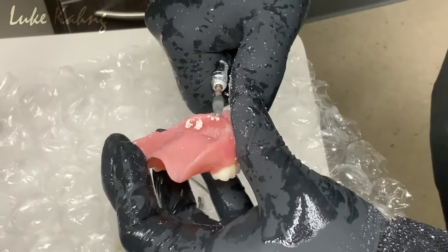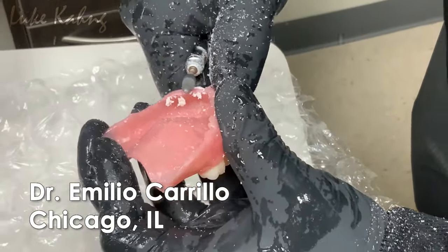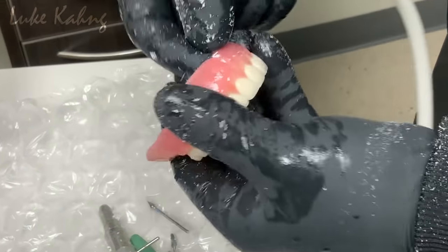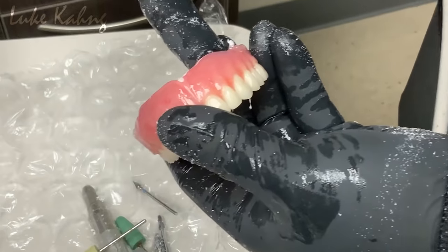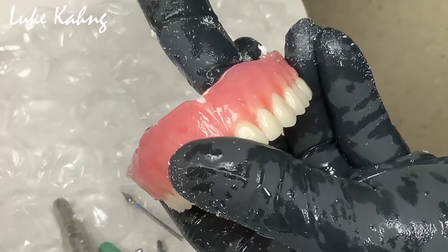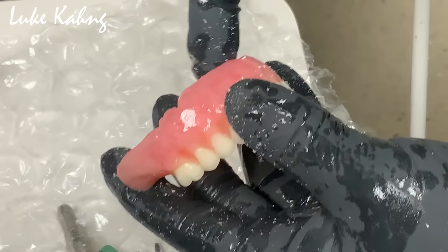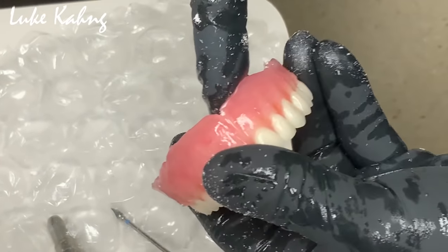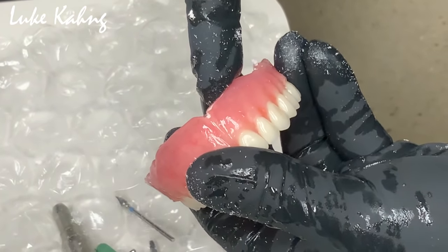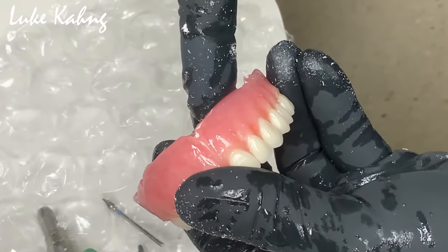So right now, usually what Luke will do is, when I send an impression for a case, they usually take my model and go ahead and take all the borders all the way up to the top. You always want to have extra and carefully and slowly make your adjustments in office.